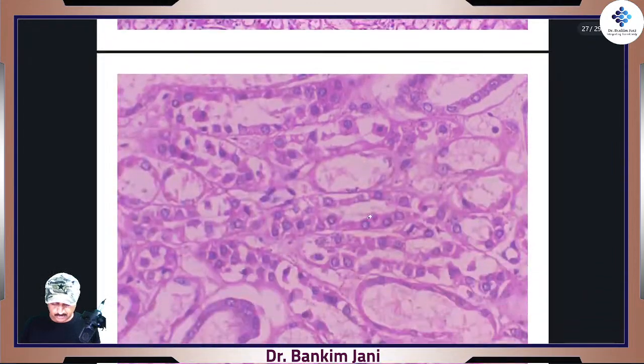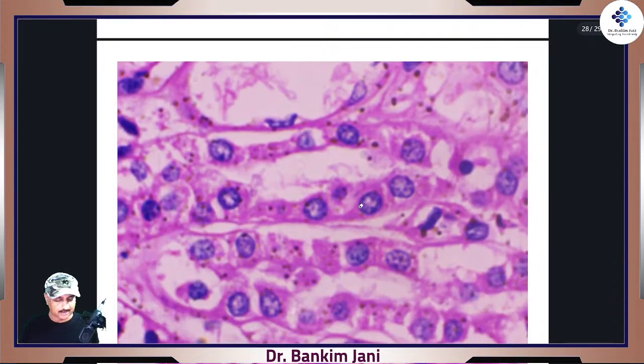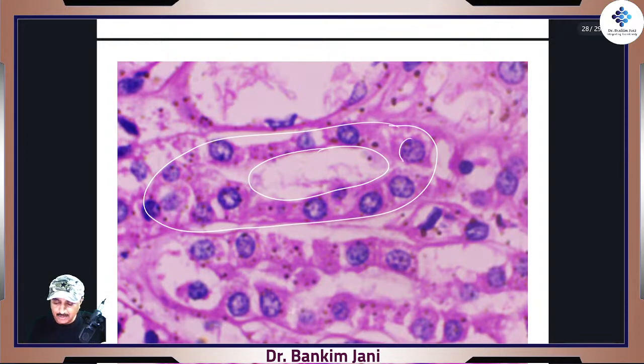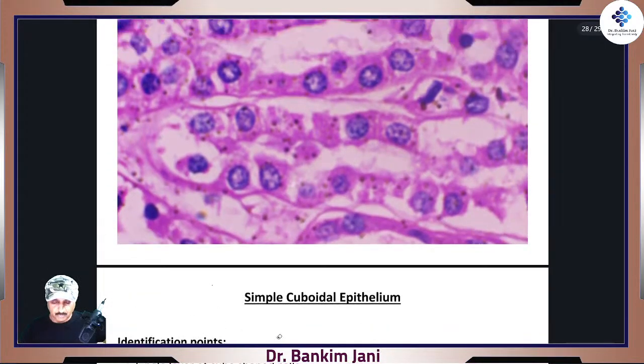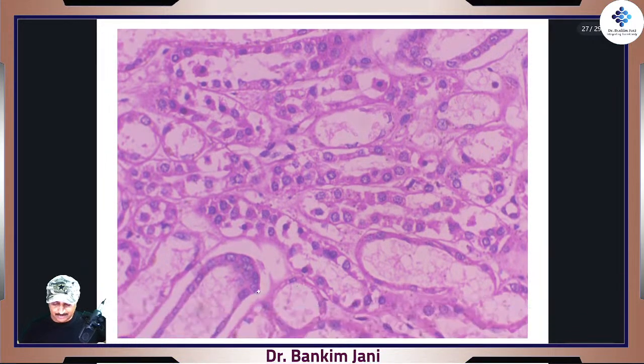We zoom first all the way down to the collecting duct, and again the pearl necklace has come up, that precious one. See, this is one collecting duct. The portion in between is the hollow one, that is the duct, and this is the wall. See how nicely big precious stones are there. And when I remove this and go back, we can see them.